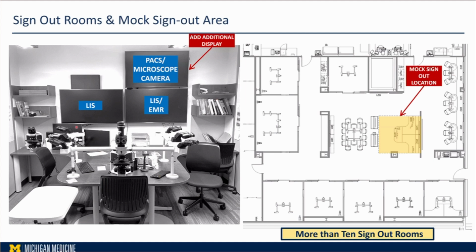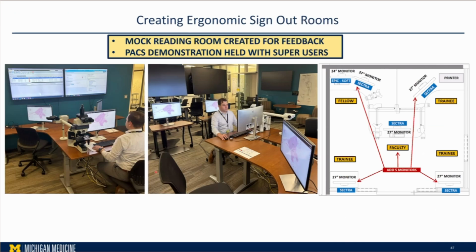You have multiple microscopes as well as the screens to sign out digitally. In the beginning, we said we're just going to put something here and call it a day. However, that was really not ergonomic. Everyone is pushing the chairs and has to look really high. So we decided, just like what we utilize right now with the microscope, to utilize multiple displays synchronized to one display, and whatever the faculty is reviewing is synchronized to have an ergonomic workflow.